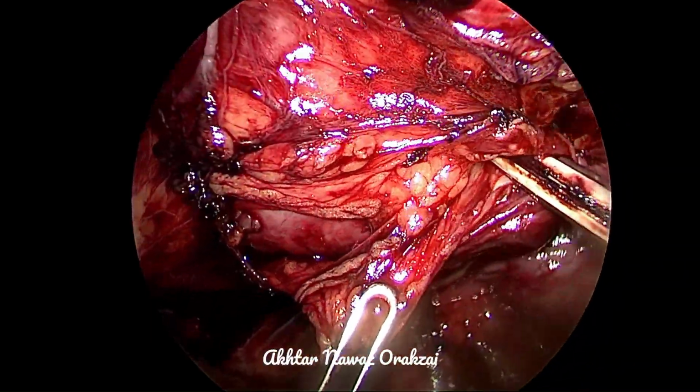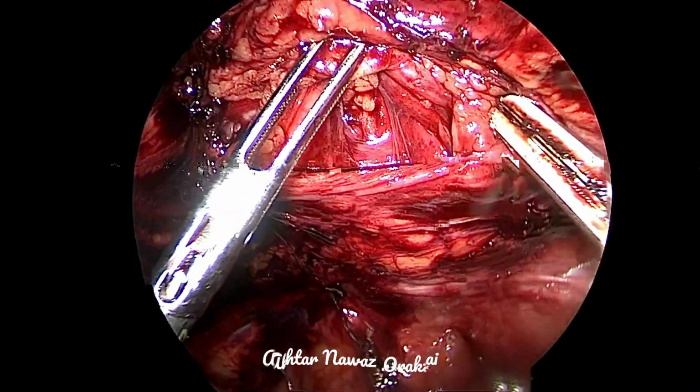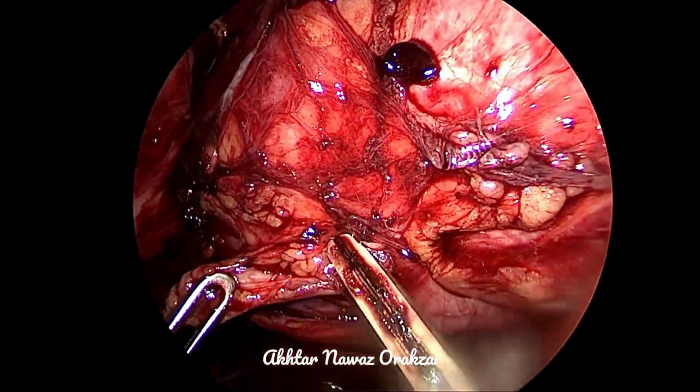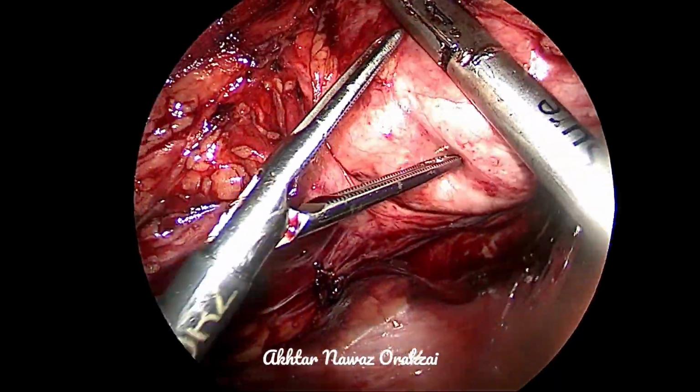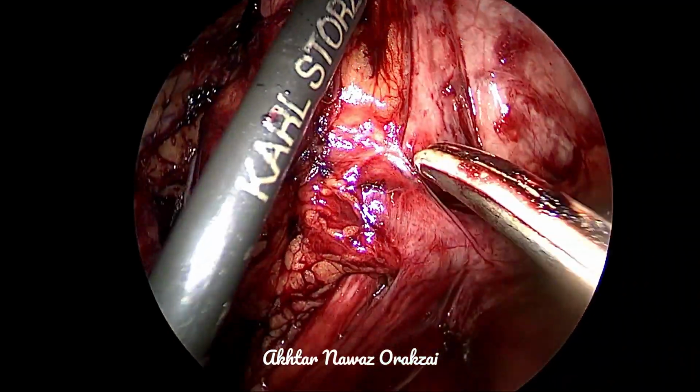So here you can see a narrow segment as well. So here both the internal as well as the external factors, which are also called the intrinsic and extrinsic factors, are playing a role in the obstruction.